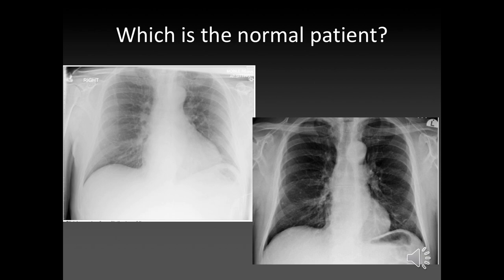So here are two films. Hands up for who thinks the film on the left is normal. They're actually both films of the same patient, and they're both normal — there's no pathology in either of them. It's just that this one is an AP film and this one's a PA film. You can see the difference it makes, and when you don't have anything to compare it against, a lot of people would say the heart's quite big, there's a bit of congestion, maybe the patient has heart failure — but it's actually not. The patient is completely fine.